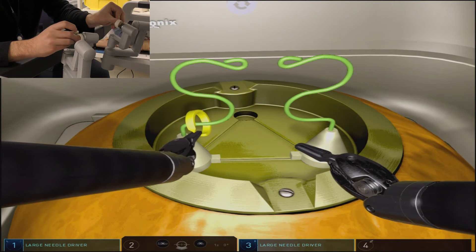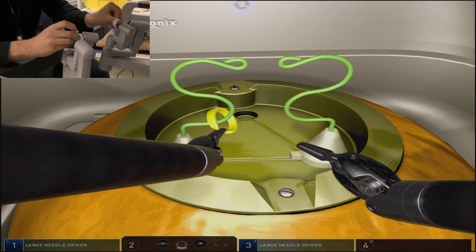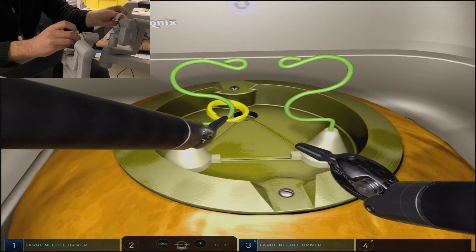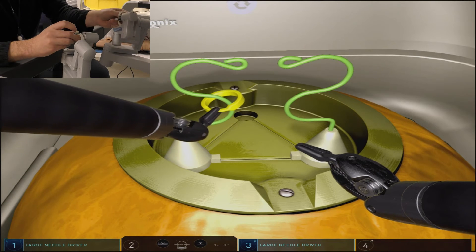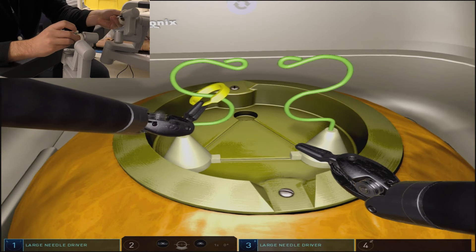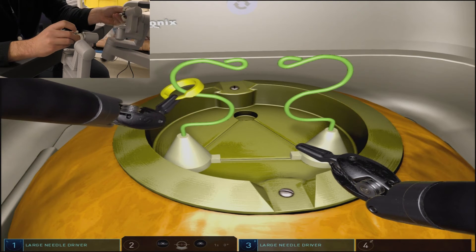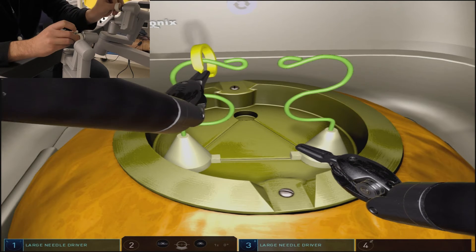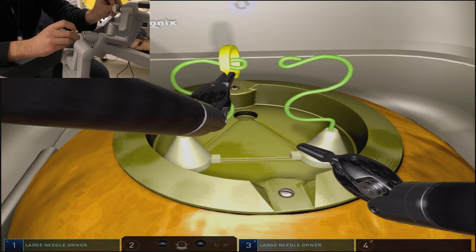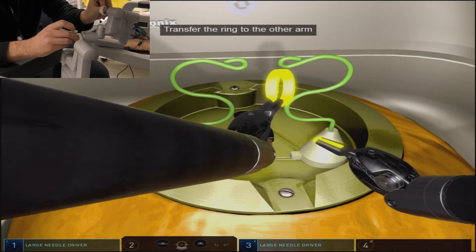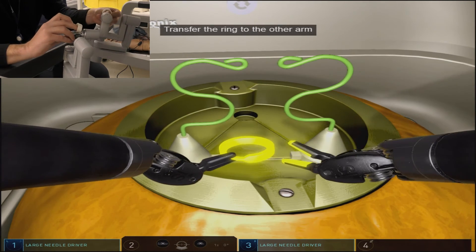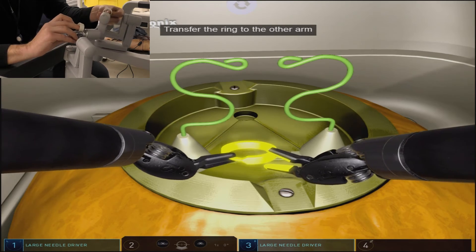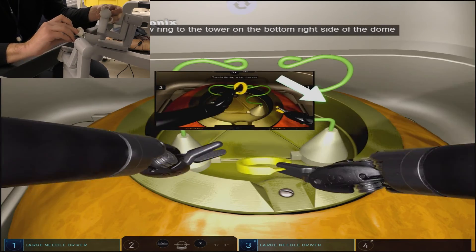Moving slowly and minimizing contact as well as minimizing excessive force is essential, as the wire structure is only loosely attached to this surface and can come off causing a critical failure in the exercise.